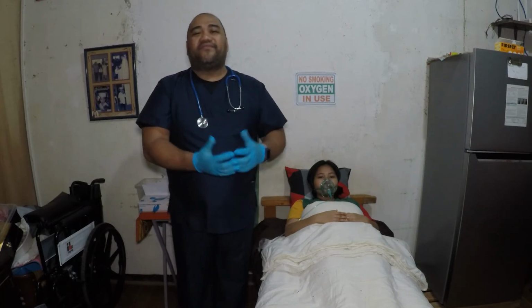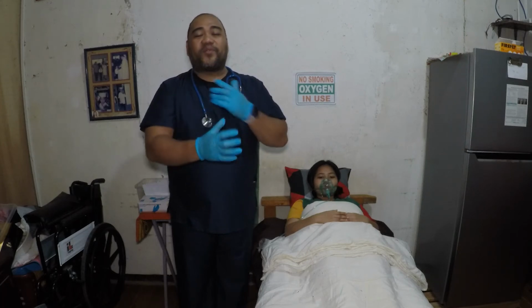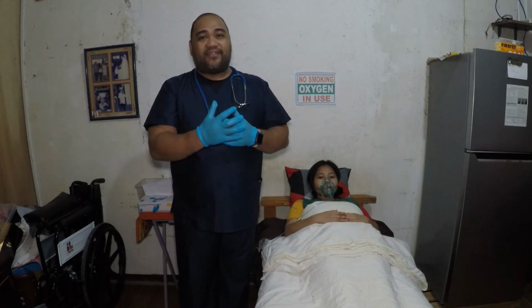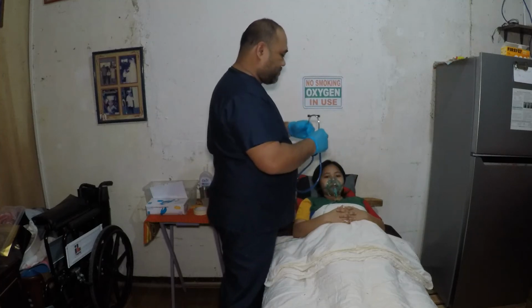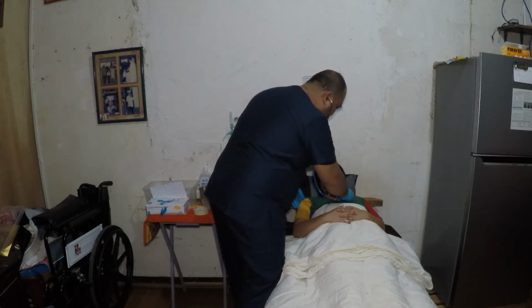So that's the only difference. The procedure of doing the oxygen administration is really the same, except for the type of oxygen device. Make sure to check the condition of your client before leaving the room in order to check the safety of our client. Okay?